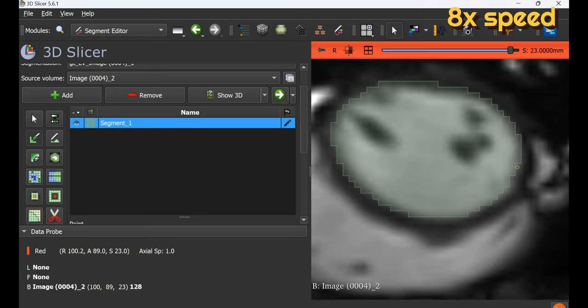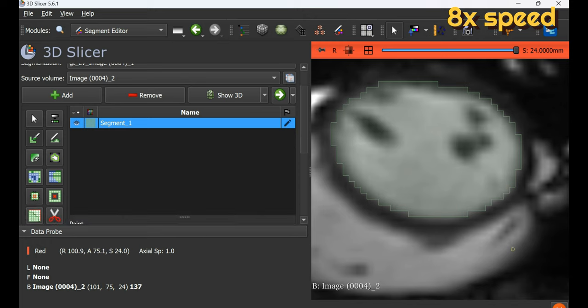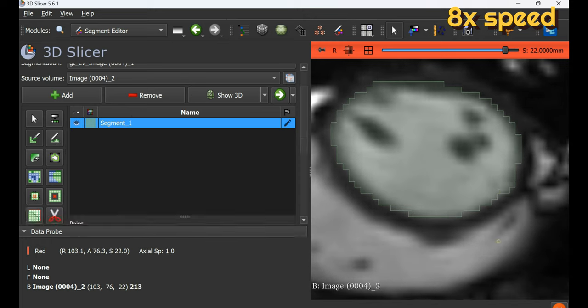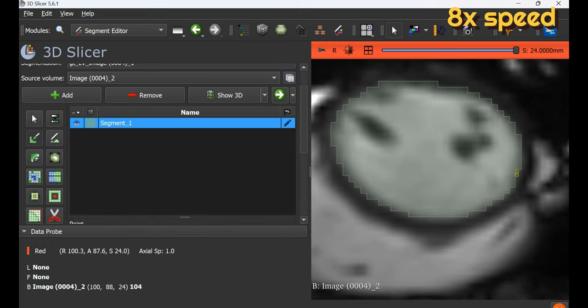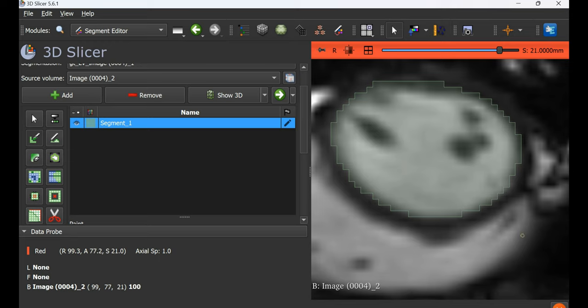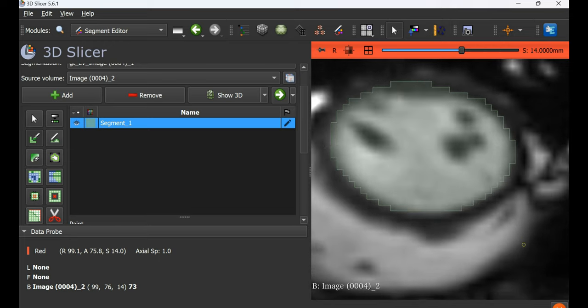If you need to exclude certain regions, use the eraser to do so. Keep in mind that Control+Z or the undo function only remembers one change in its memory.